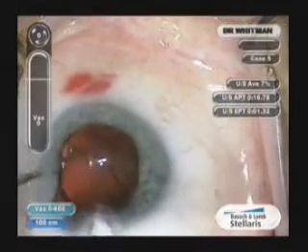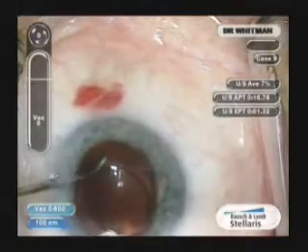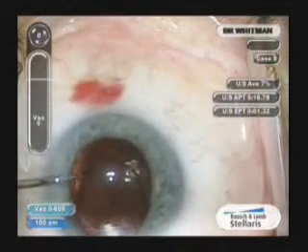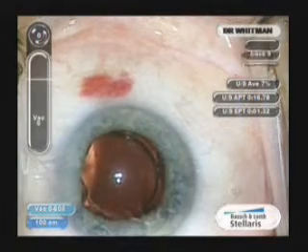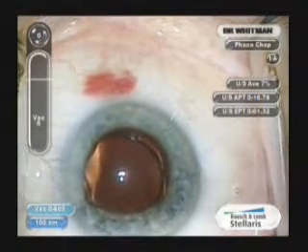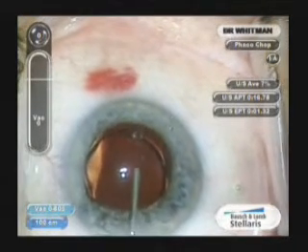The trailing haptics will be laid on the superior iris, or in this case the temporal iris. The lens is very user-friendly, very malleable, and self-centers very nicely. We simply hyperinflate the anterior chamber and bag with viscoelastic.